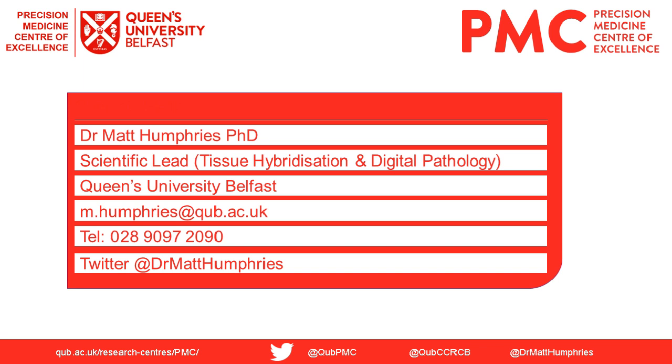Thanks, Matt. Next question. You mentioned having the H&E on the tissue. Is that an artificial H&E or is this an actual H&E stain on the same tissue? No, it is an actual H&E. So we first perform the fluorescence staining and then we perform a regular H&E as you would do on any other slide. So it's not an artificial H&E.